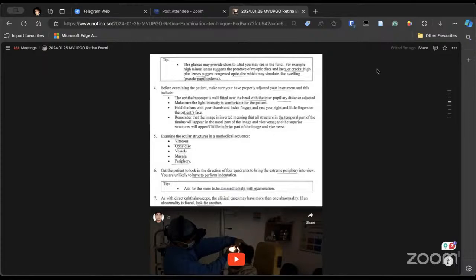To examine the vitreous, I look for the vitreous haze, whether the underlying retinal vessels and disc vessels can be seen, and anything floating in the vitreous, like infiltrates. And other than indirect ophthalmoscopy, is there any other way to examine the vitreous? Slit lamp with 90D examination. Okay. In slit lamp, what specifically will you see in the vitreous?